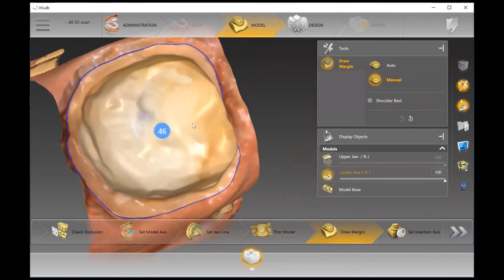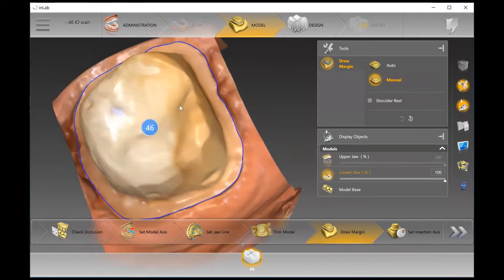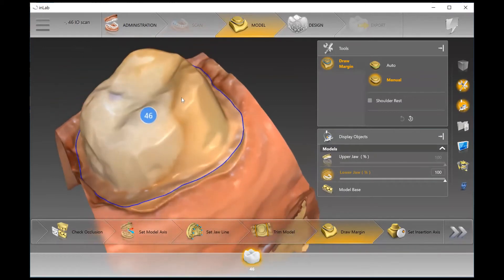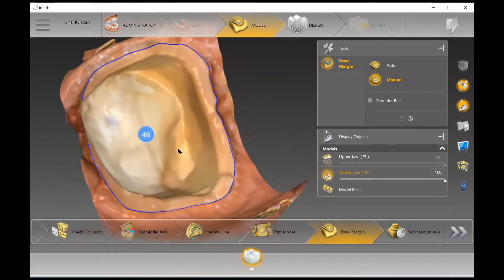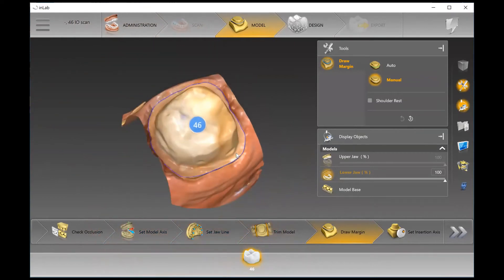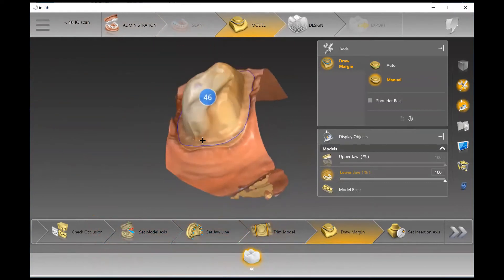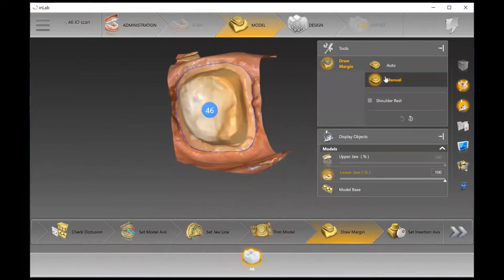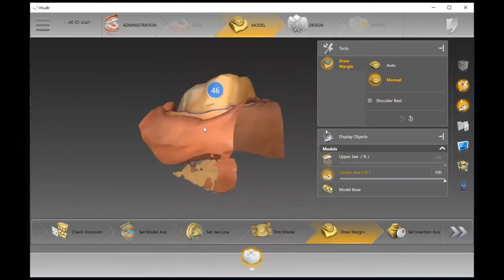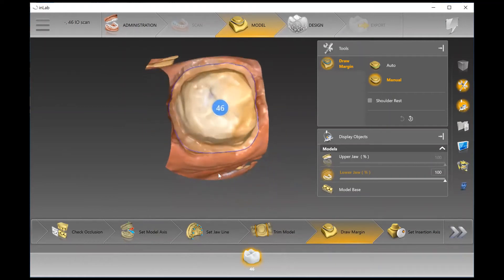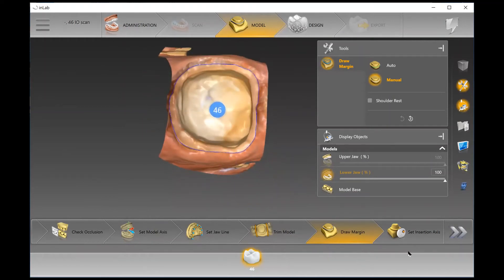When we're marking our margins, the software does try to find the margin for you. Also, when it's an intraoral scan, the doctor can mark the margin on their side of the software — which is what we're seeing here. If you need to adjust anything, you can. However, if you want to keep it exactly where the doctor marked their margin, you don't have to do anything in this step.